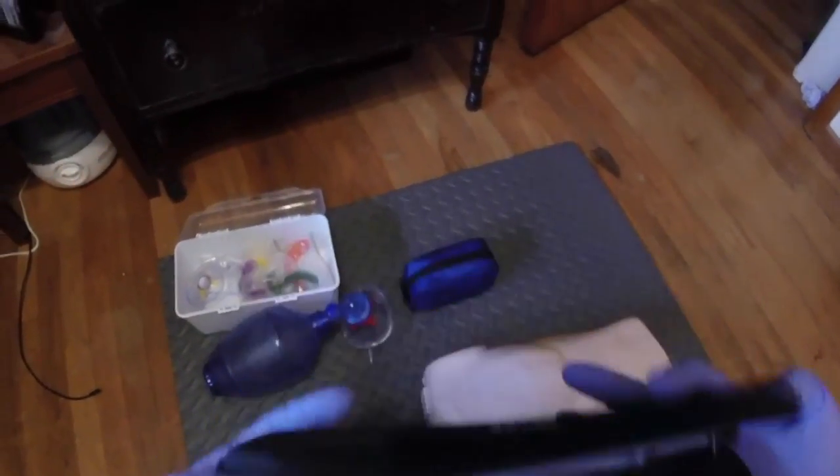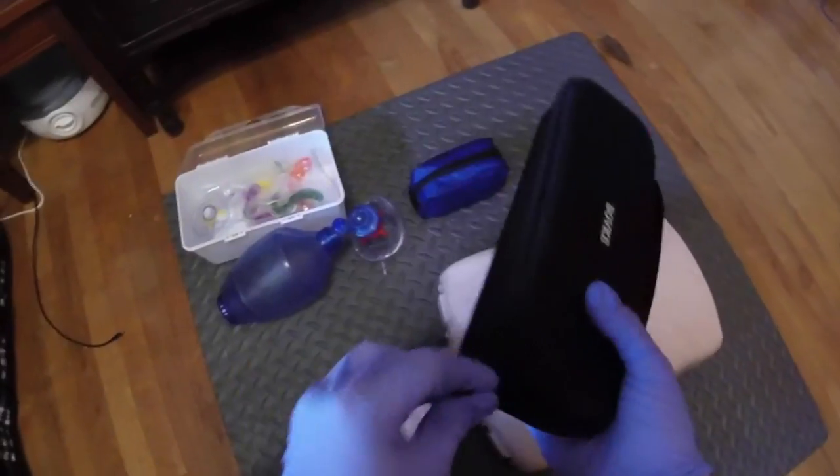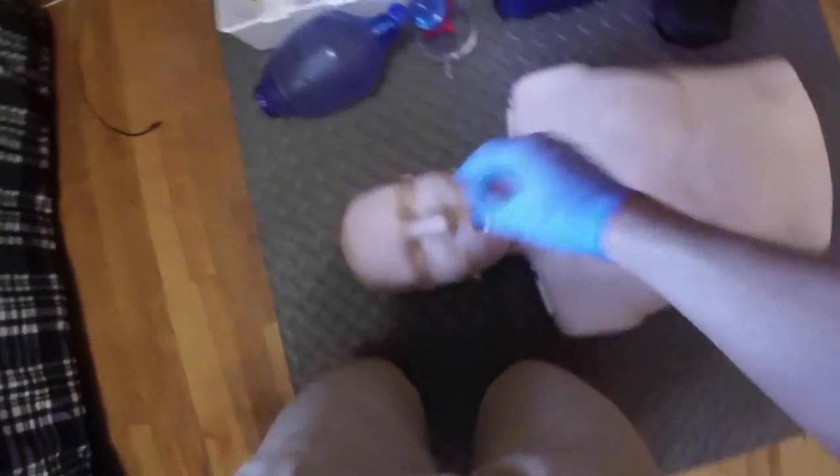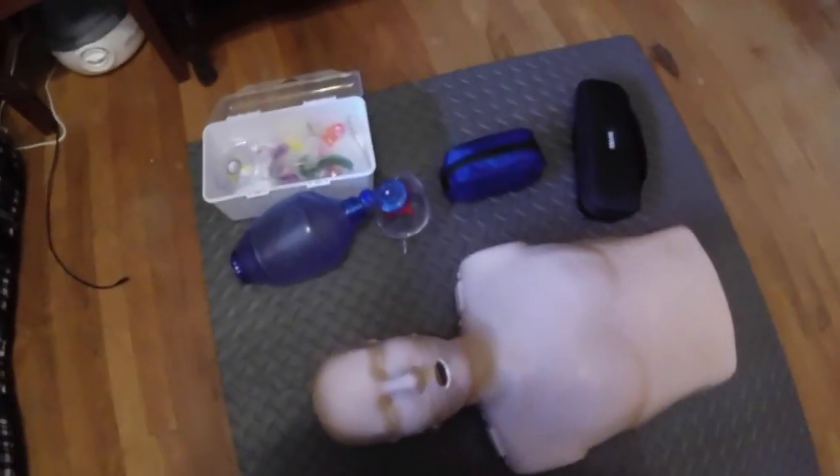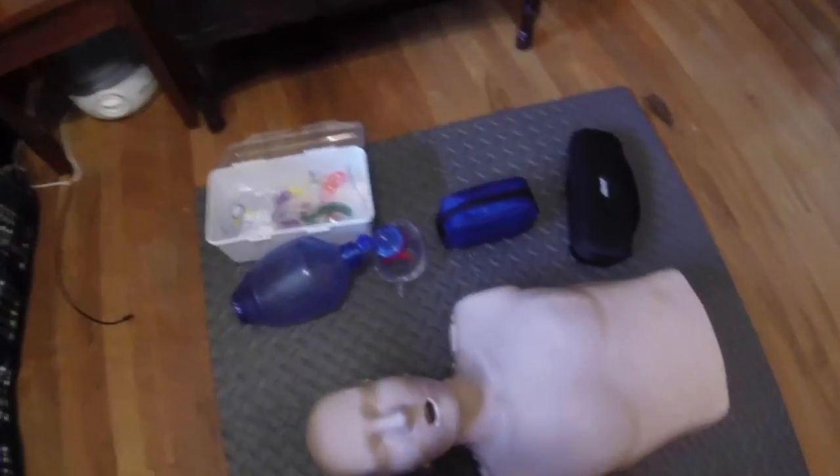I also have trauma shears and a pen light for practicing my secondary assessment, where I check for pupil function, look in the mouth, nose, and ears, and so forth, looking for any drainage or blood.